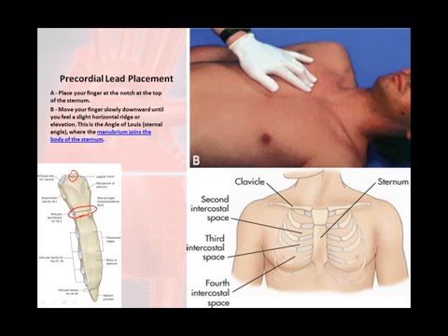Once you find this spot right here, this is your second landmark. You're going to start here and migrate your fingers down until you feel that joint right there.